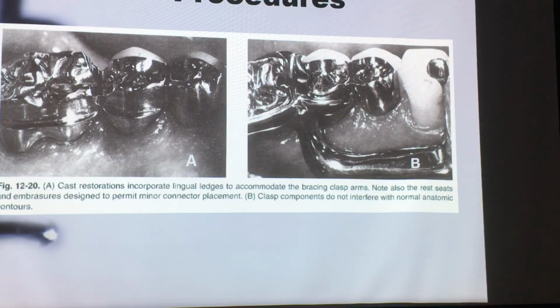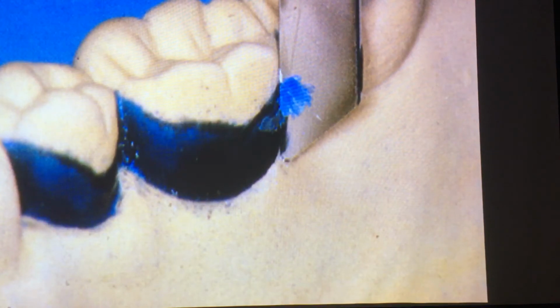But our surveyor, whether it's a high fancy one to do the milling of those ledges, or we will use the wax scalpel to scalp out those ledges in our wax up of our crowns. So now you're thinking, wow, okay, partial denture technology meets crown and bridge class. They are separate for today, but in the future it's all one. Here's a picture on the next slide of using the scalpel wax blocking out undercut is all I'm doing. Just trying to simulate maybe the ledge of a crown.